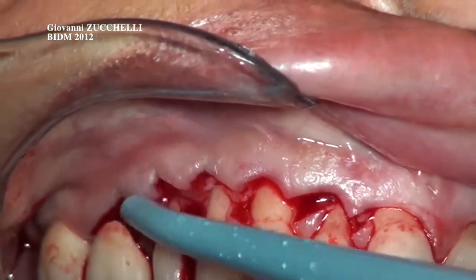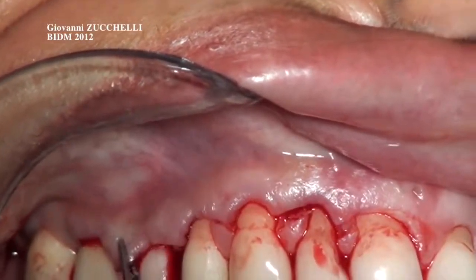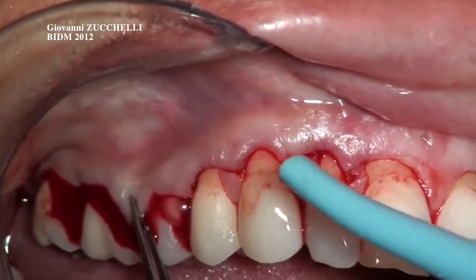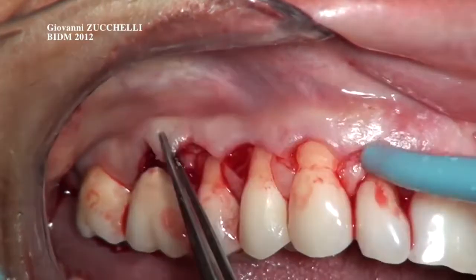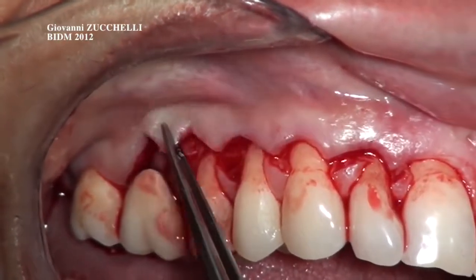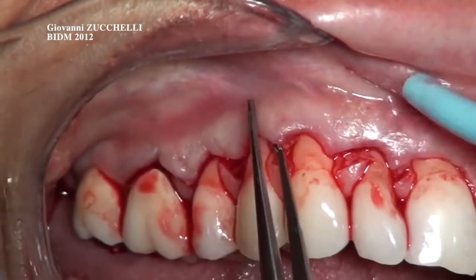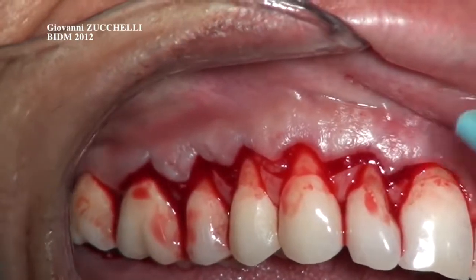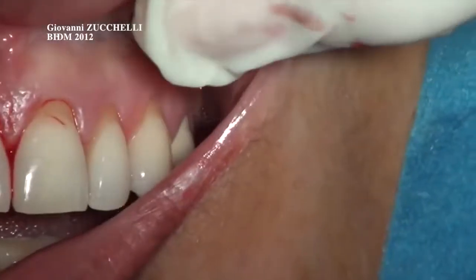By this movement, it is possible for the surgical papilla of the mesial to rotate in the distal direction, passively, and cover completely also the mesial root of the molar. At the same time, the premolar, canine, and lateral are covered. Now we have to do the same thing for the central incisor.